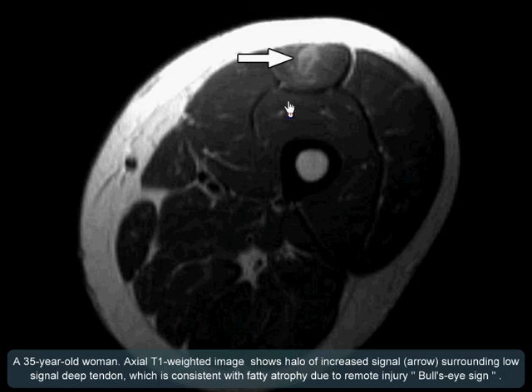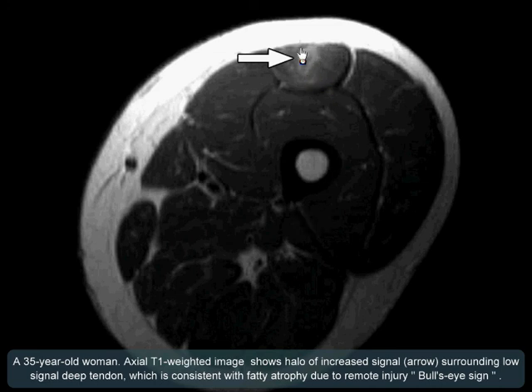This case is a 35 year old woman. Axial T1 weighted image shows a halo of increased signal surrounding the low signal tendon, consistent with fatty atrophy due to remote rectus femoris deep tendon injury.